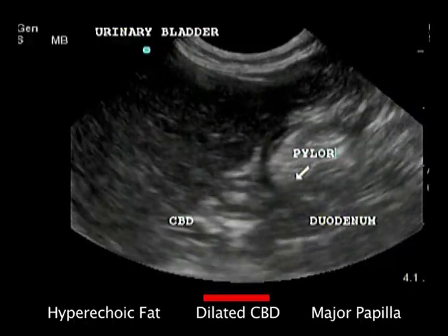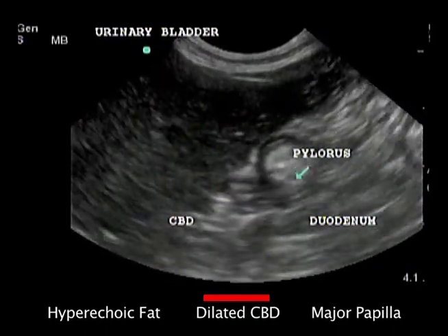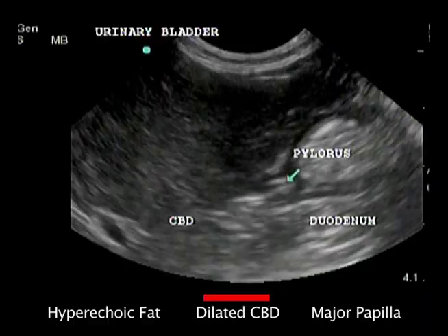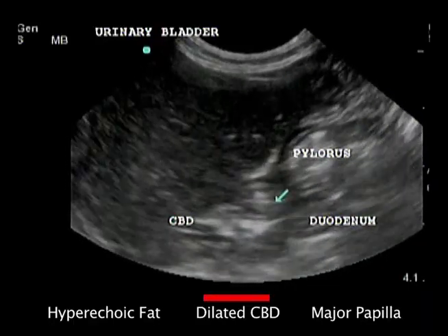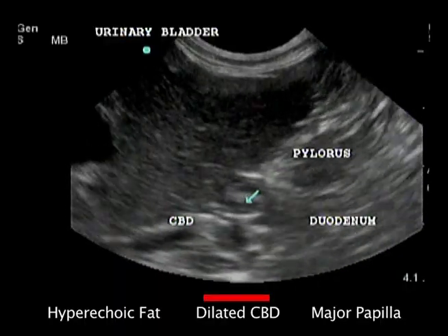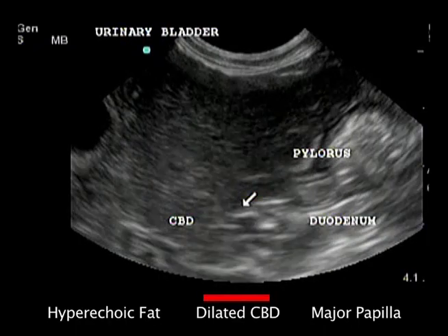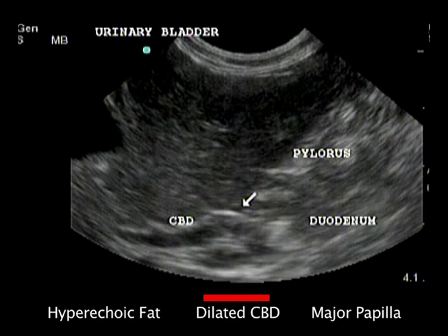The common bile duct is dilated in this 16-year-old, 6-pound cat with inflammatory bowel disease. Total bilirubin was normal. The common bile duct is ventral to the extrahepatic portal vein and does not show color with color flow Doppler. It connects to the major duodenal papilla of the duodenum just distal to the pylorus of the stomach. The common bile duct is not seen in every patient every time.